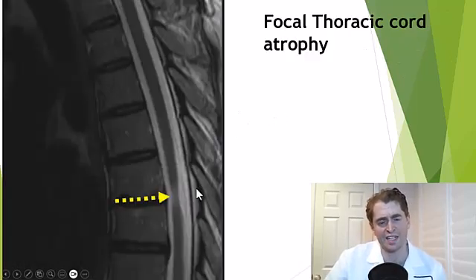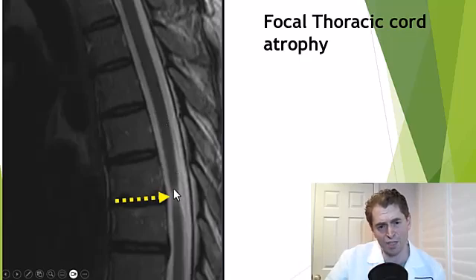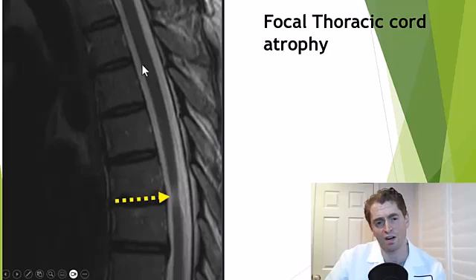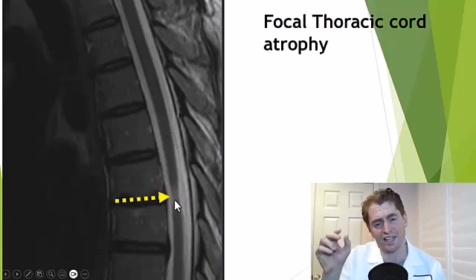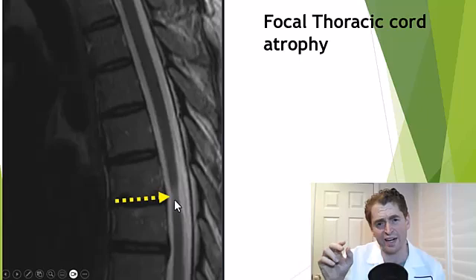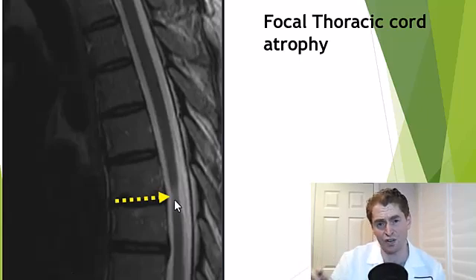This is an example of focal thoracic spinal cord atrophy. You can see higher up there's a normal caliber of the thoracic spinal cord, but at the area of this lesion it's clearly narrower, indicating permanent tissue injury.